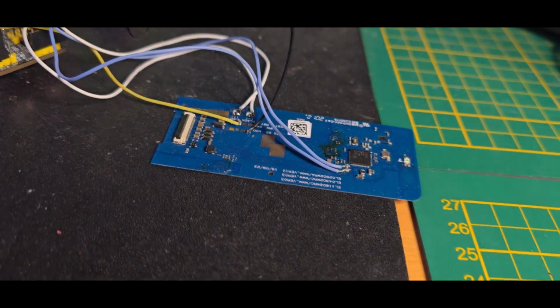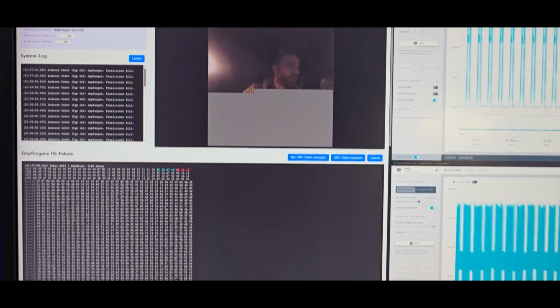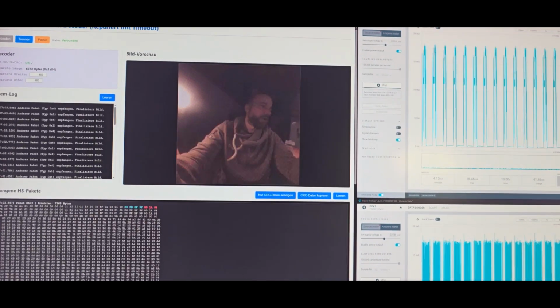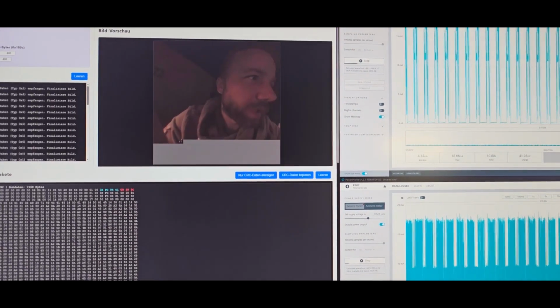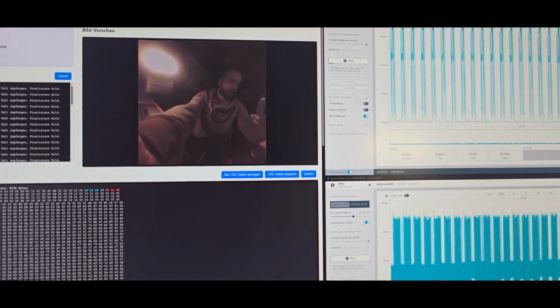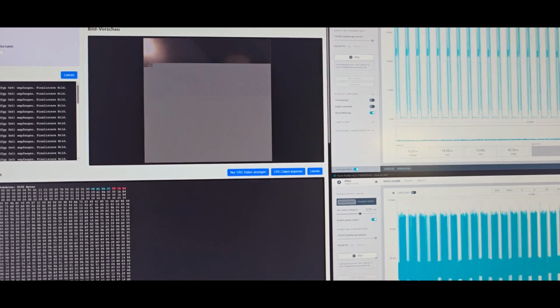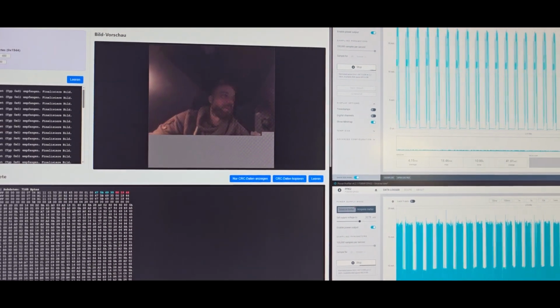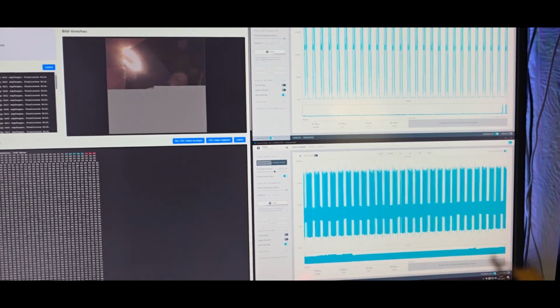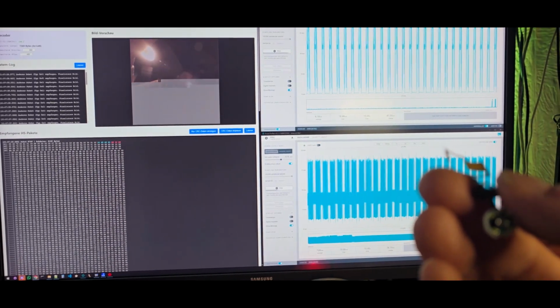It is received by the other CC1310 and passed on to this super simple web tool. And yeah, as you can see, it tries to decode the image, and every now and then you can see it's also failing, but I'm quite happy with it. And it's really an impressive fisheye lens they made into it. And yeah, you can do some settings like zoom and resolution settings as well. I played a bit around with it, but I'm happy with it as it is now and will not do anything much further than this, because from a zero or unknown camera to this, it's quite nice.